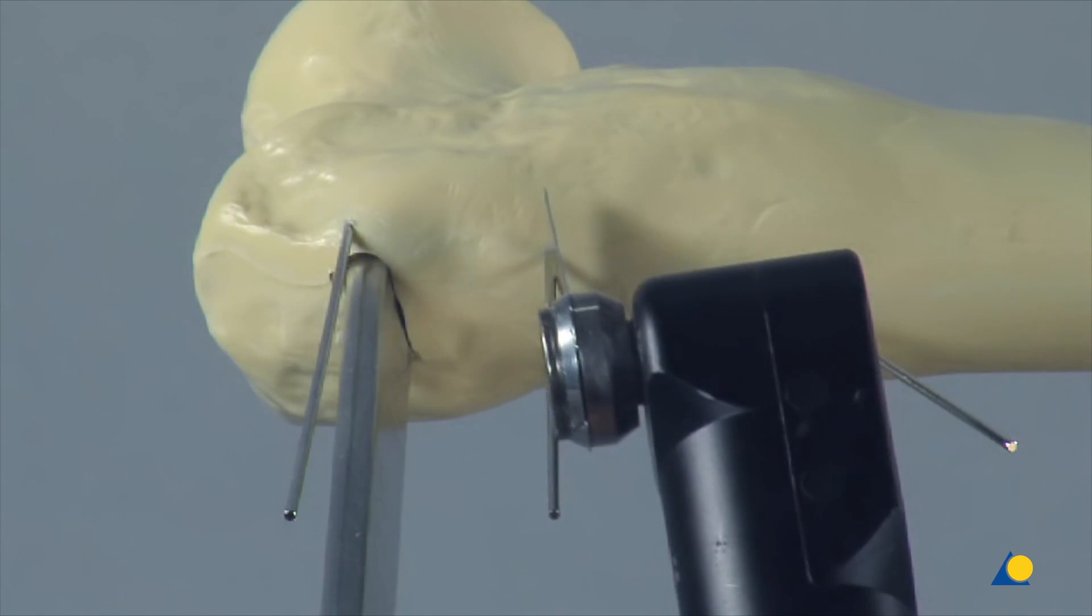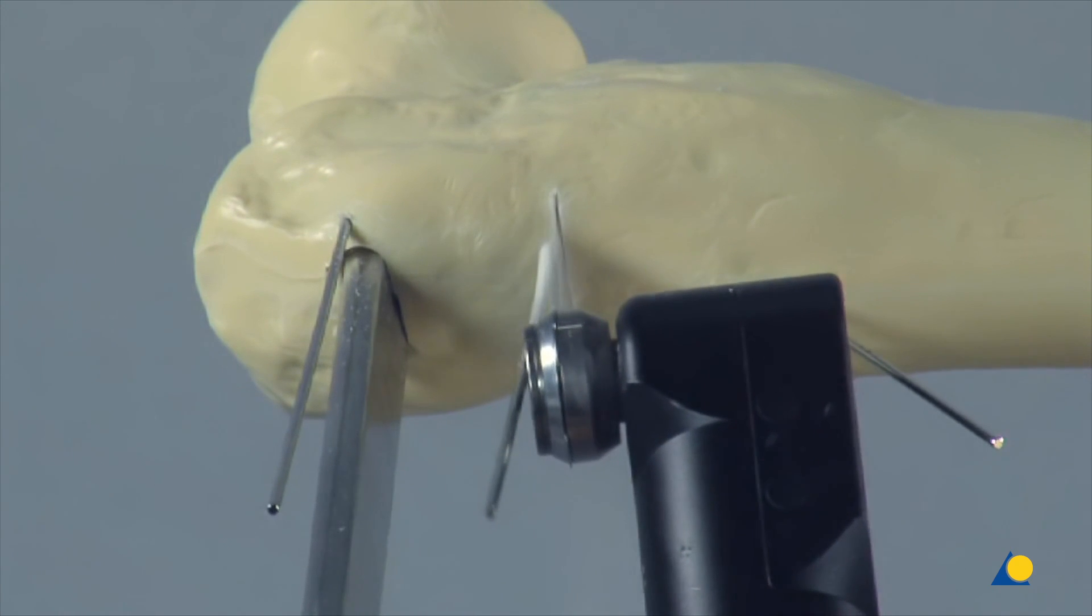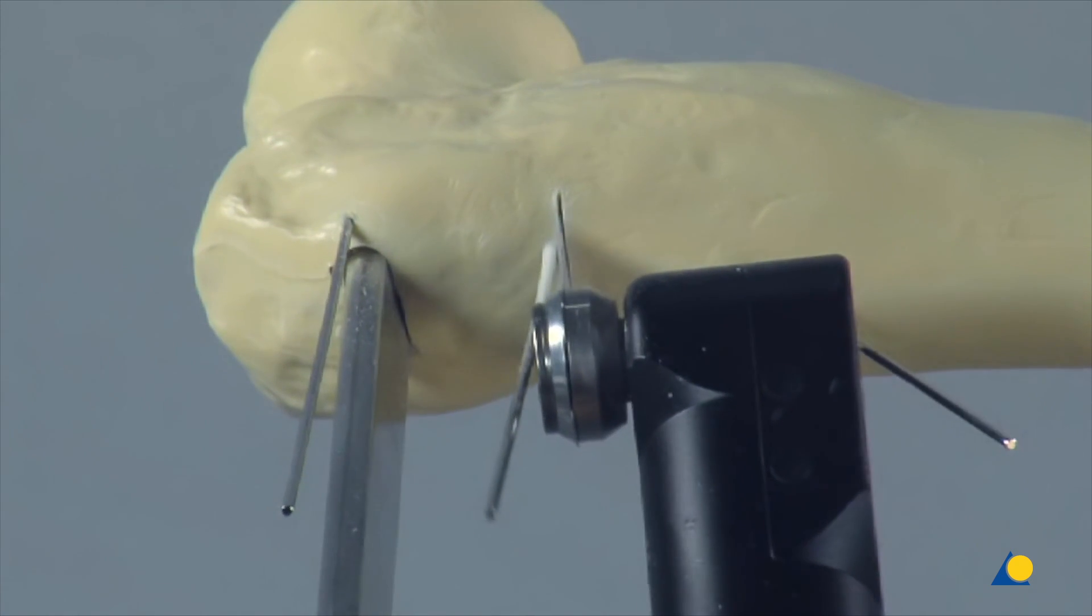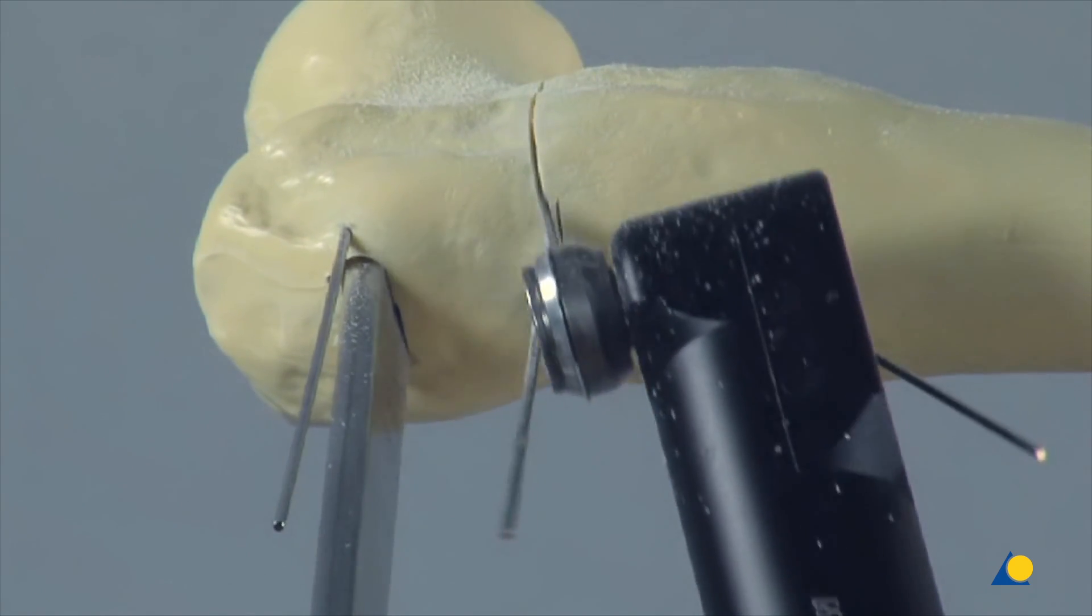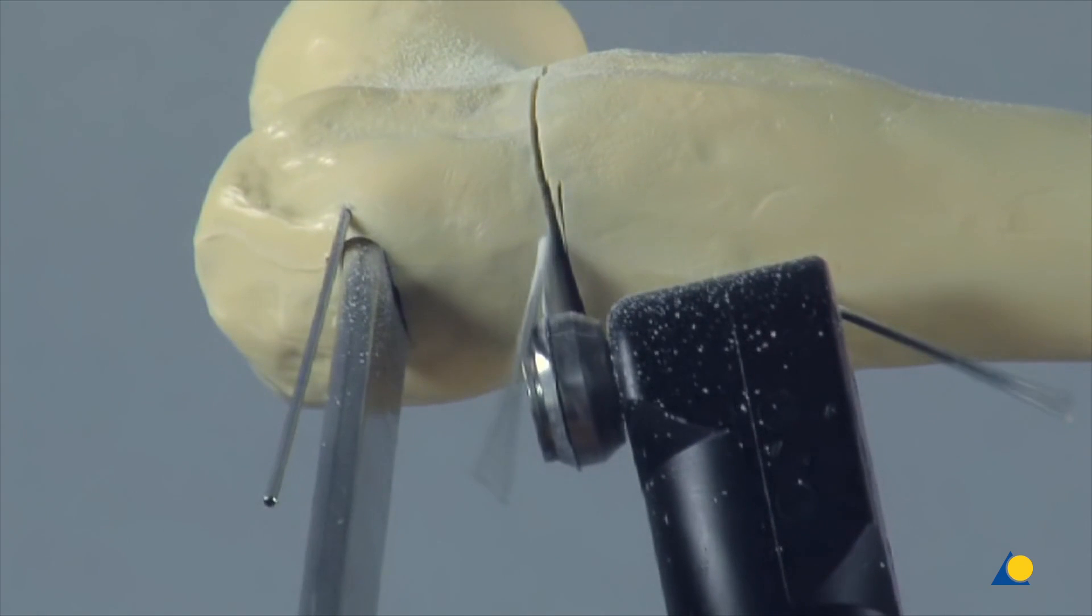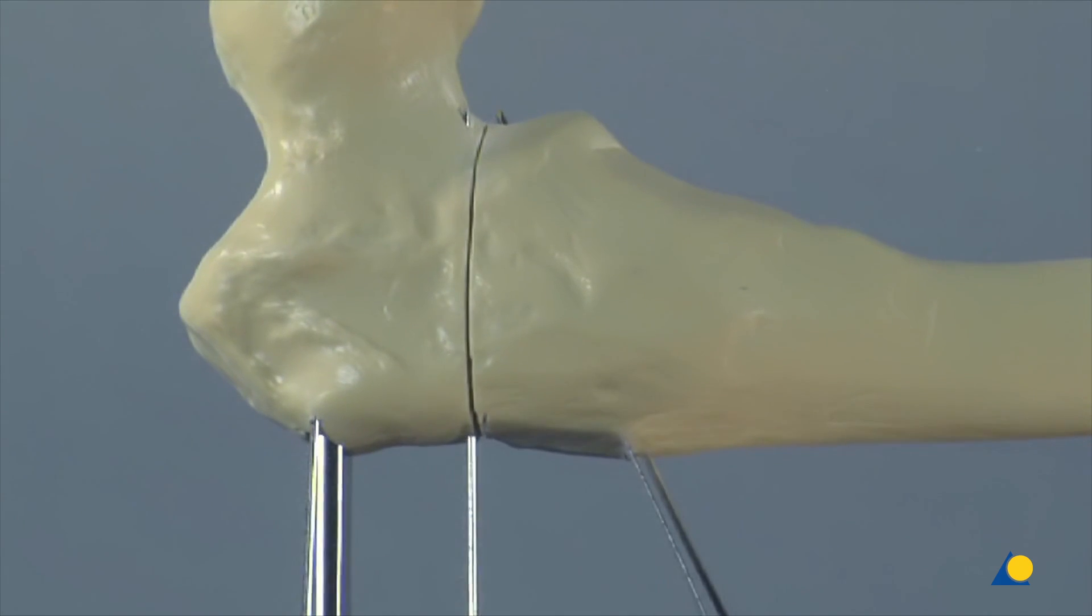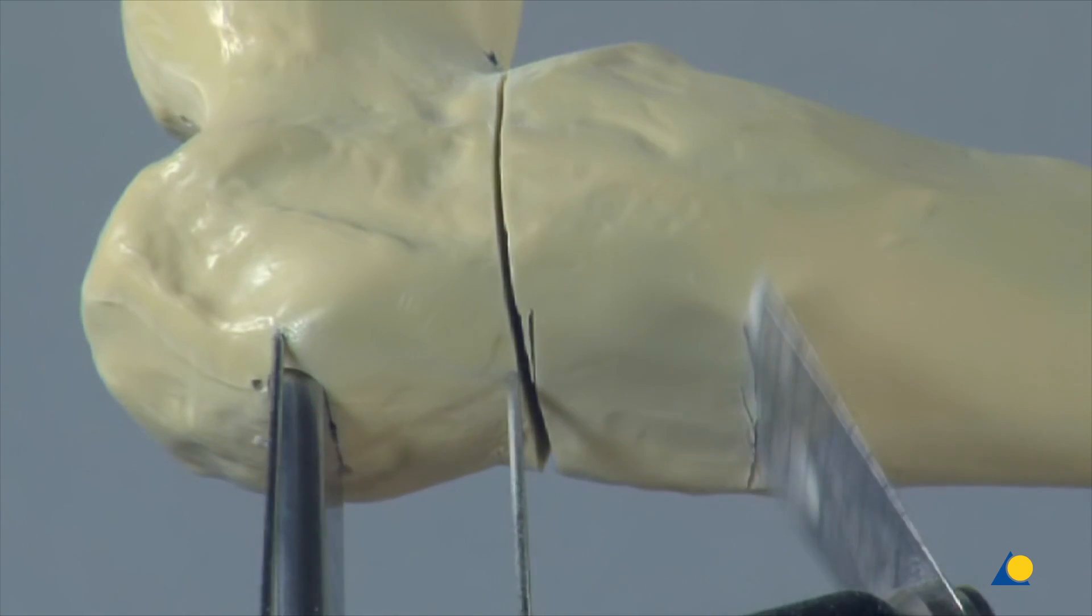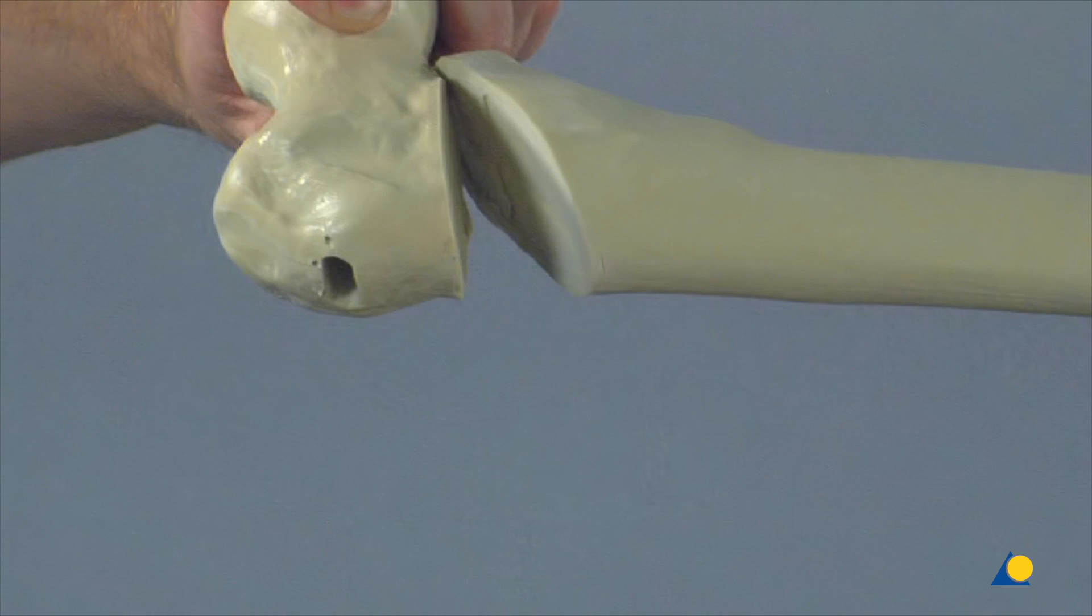The proximal osteotomy cut is made using the K-wire as a guide. The second osteotomy cut is made perpendicular to the axis of the femoral shaft. The correction angle between the first and second osteotomy cuts is achieved.